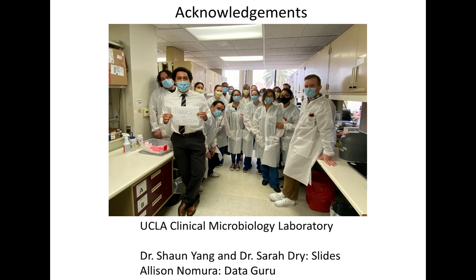Well, I think that PCR does a good job of diagnosing acute disease. You could imagine a scenario where IgM may be able to supplement that, but I think the challenge is if there's an IgM test that is presented as an acute disease test, it'll attempt to replace PCR, not supplement PCR, and I think that that's dangerous because IgM will come up later than PCR positivity.